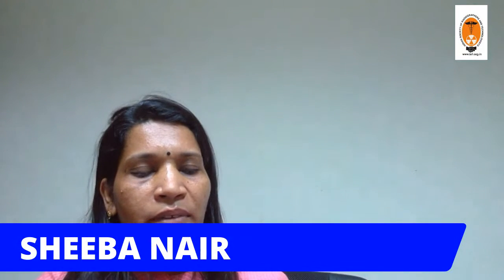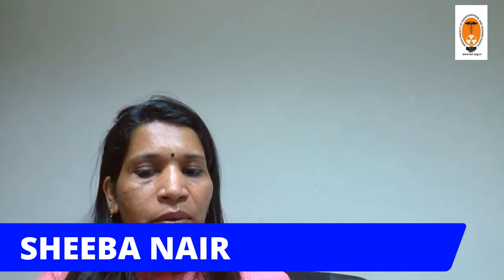Another question is, if a patient comes to the MR department with a shunt in situ, as an MRI technologist, what precautions should we take, or what should we advise a patient who has a shunt? Actually, we have done such cases. If 1.5 Tesla is available, we can preferably do scans in 1.5 Tesla. We can also instruct the patient about possible sensations, like any heat sensation or anything unusual, and they can report to us immediately.